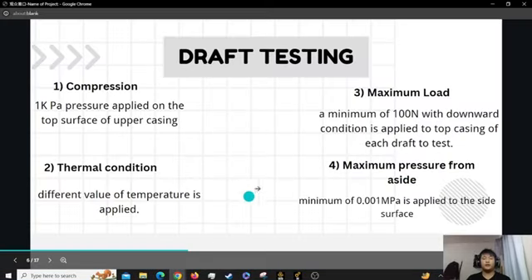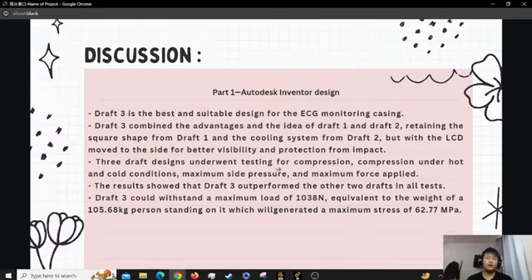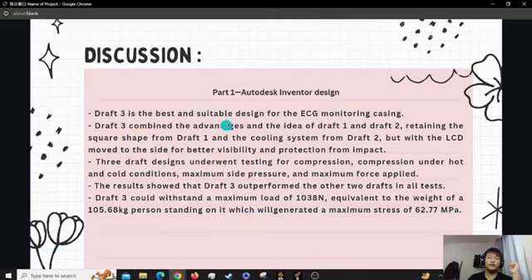draft cannot bear it. After we apply these four tests, we find that draft 3 is our best, our strongest design. The result shows that draft 3 outperformed the other two drafts, meaning it performs very well. Draft 3 can withstand a maximum load of 1038 newtons, which is equivalent to the weight of a 105 kg person standing on it. Besides that, draft 3 is the best and most suitable design for the ECG monitoring casing.